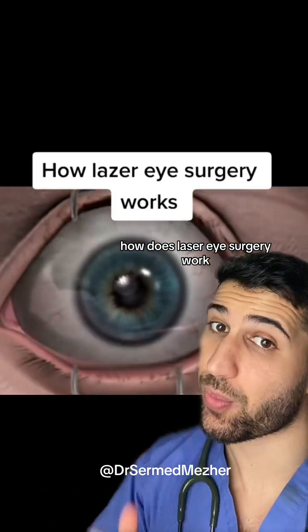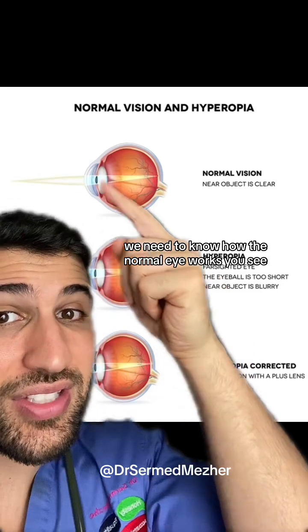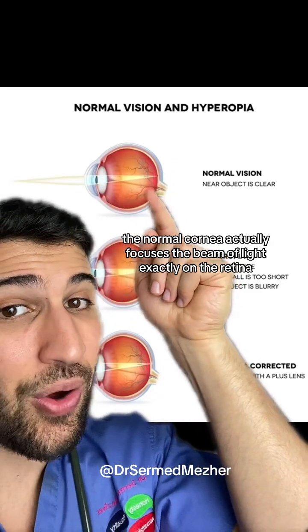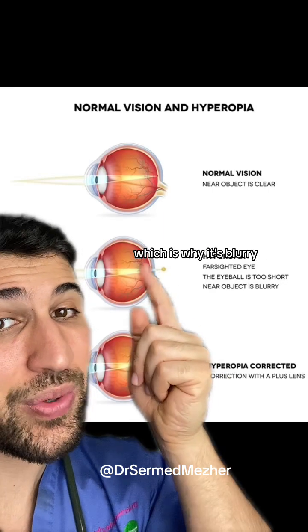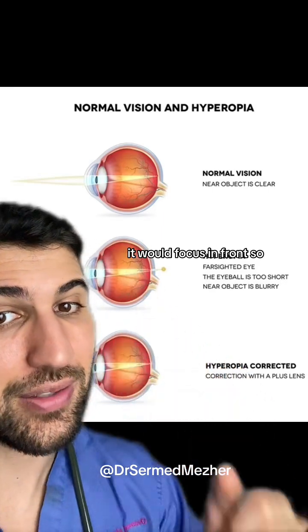How does laser eye surgery work? To understand that we need to know how the normal eye works. The normal cornea focuses the beam of light exactly on the retina, whereas with a far-sighted eye it focuses behind the retina, which is why it's blurry, and with a short-sighted eye it would focus in front.